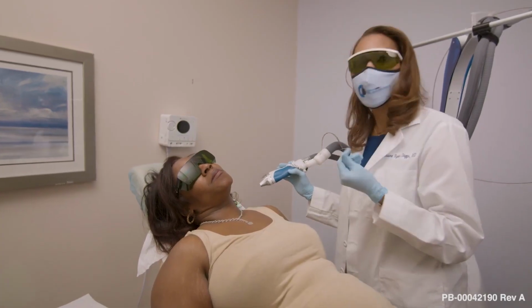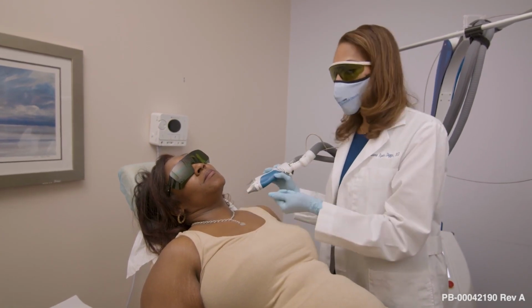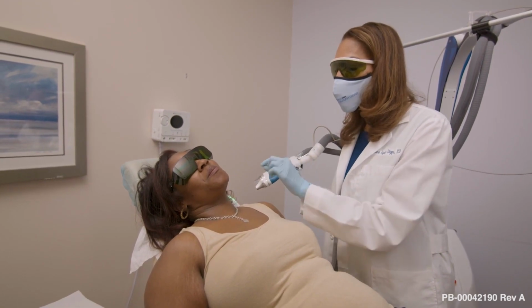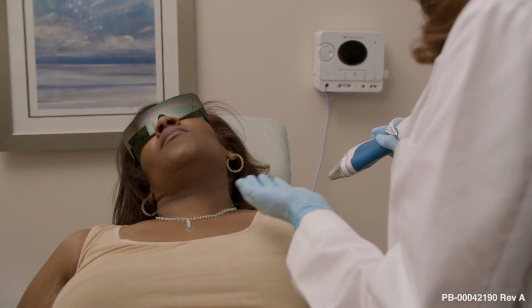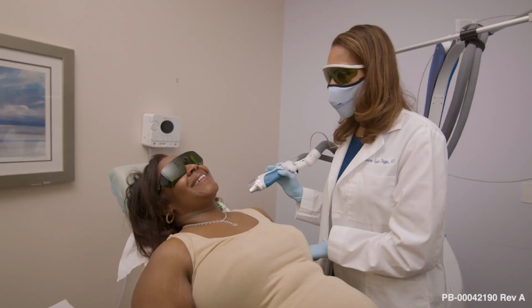Great results. So I could smell a little bit of hair, even though earlier I couldn't really see it, but I could smell that finer vellus hair. I can smell a little bit, see a little bit of crinkling. She has a slight hint of erythema, but looks great. Looks great. How does that feel? Good. Good. Okay, good. Yes.